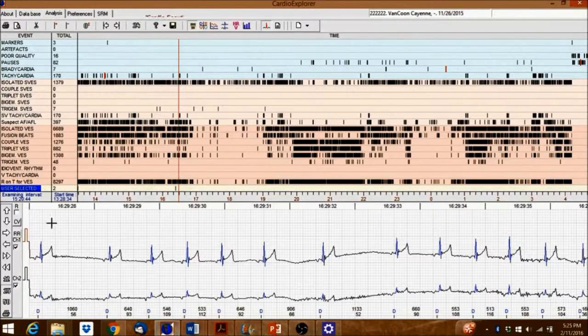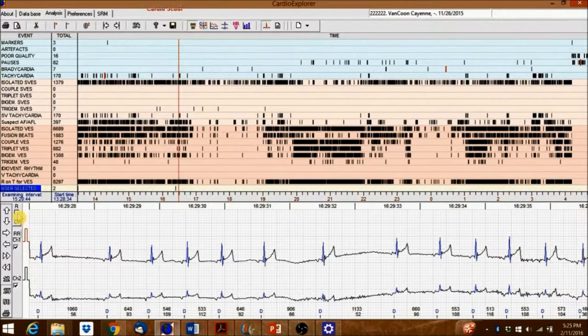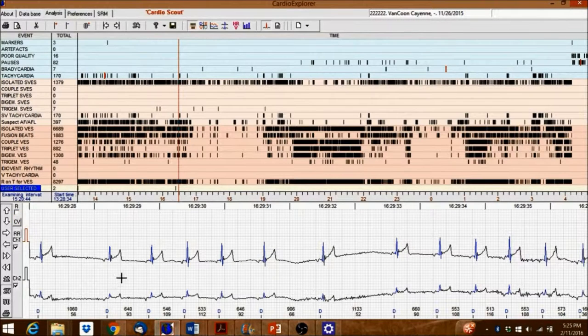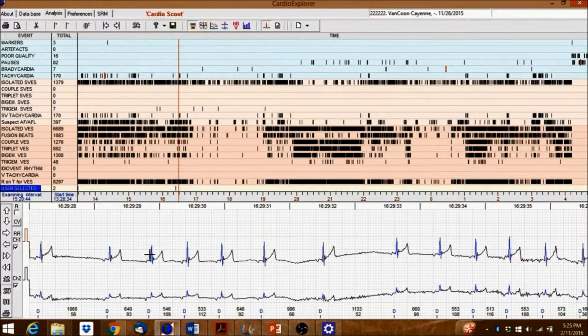The R box when unchecked allows a user to make measurements over one or multiple beats.